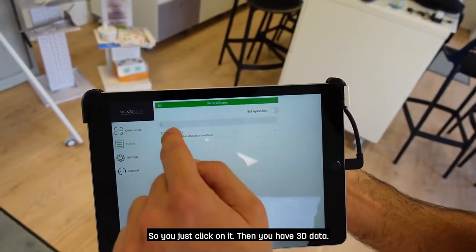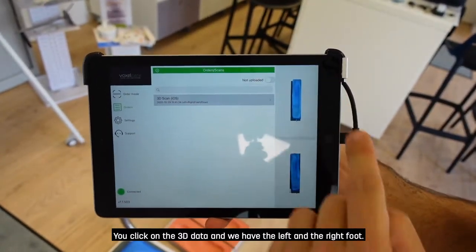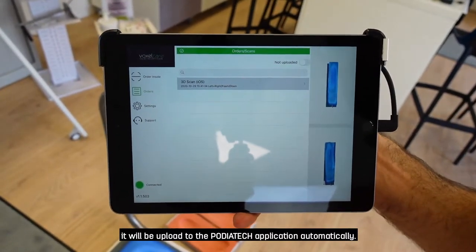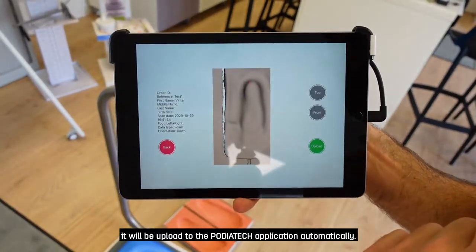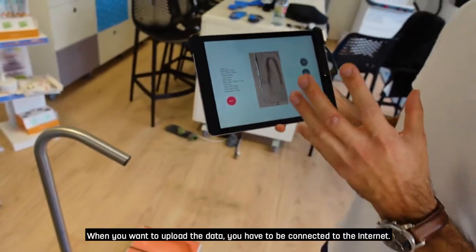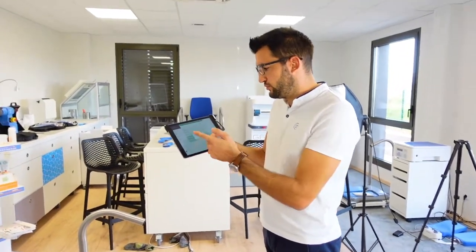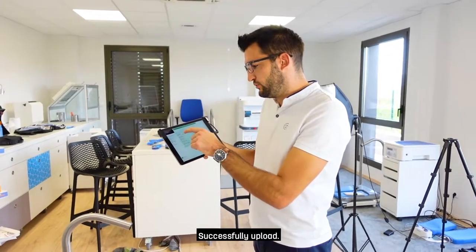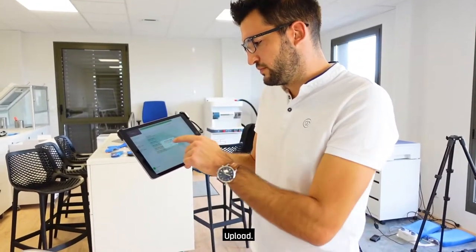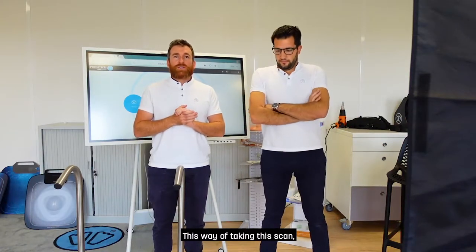Go back to the Voxel Scan application and go to Order. You will see 'Test One' from today with the date and time — to be sure it's the right patient. Click on it, then on the 3D data, and you have the left and right foot. Click on each one and it will be uploaded to the Podiatek application automatically. Click Upload — you need to be connected to the internet to upload. Upload successfully — then do the same for the other foot.